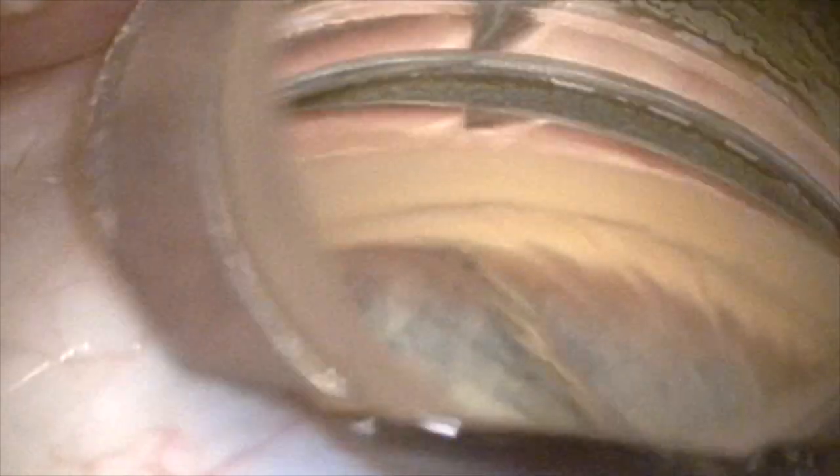Here we've rotated the patient's head 30 degrees away from the surgeon and the microscope 30 degrees toward the surgeon. I can visualize the stent, focus on the trabecular meshwork, and now I'm passing the eye stent through trabecular meshwork into Schlemm's canal, and you can see it slide nicely.